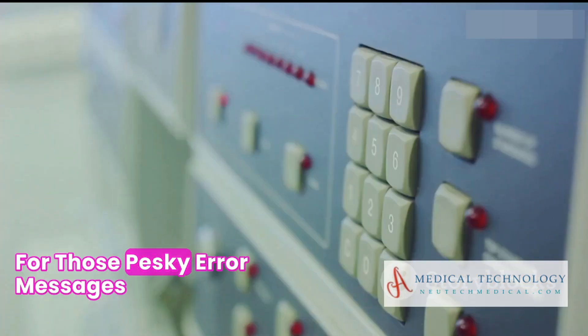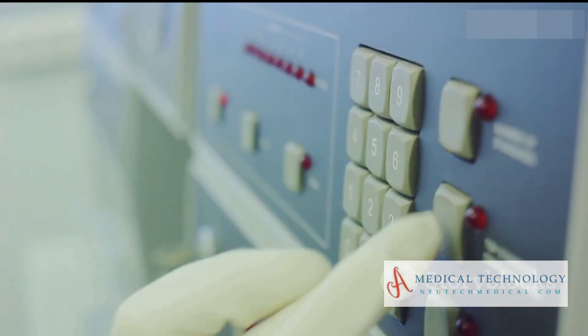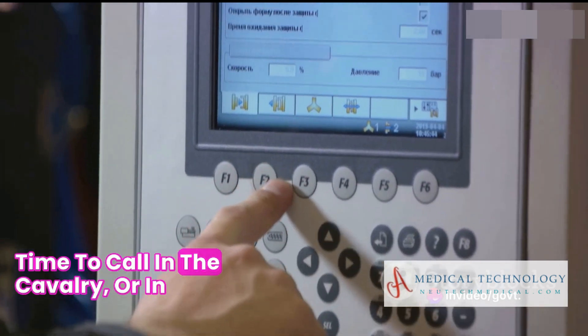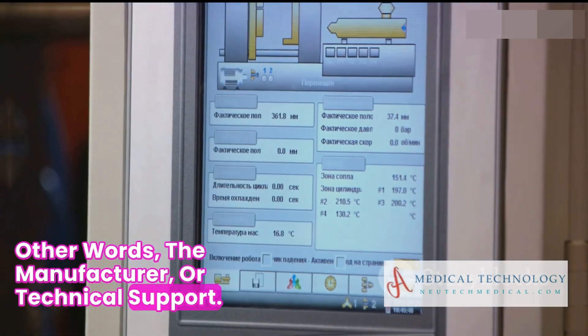For those pesky error messages, refer to your machine's manual. Every error code has an explanation there. If the error persists after a reset, it's time to call in the cavalry — or in other words, the manufacturer or technical support.